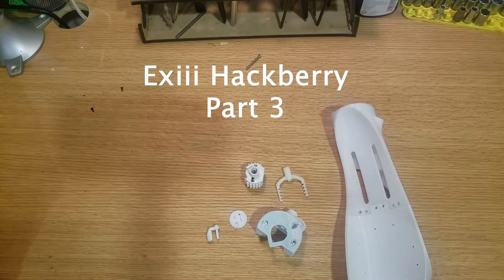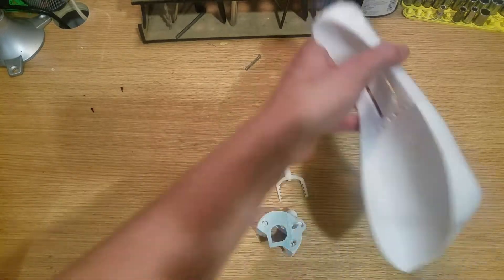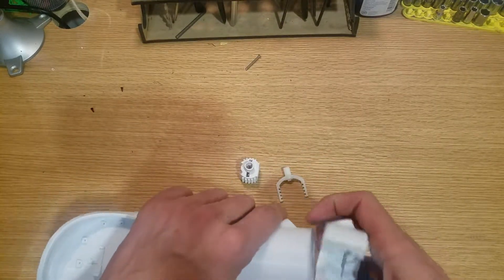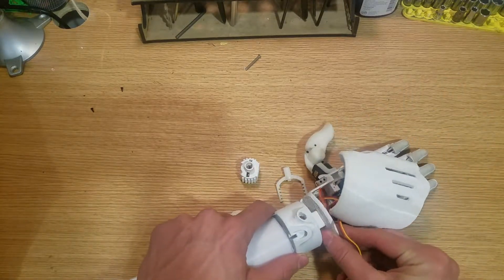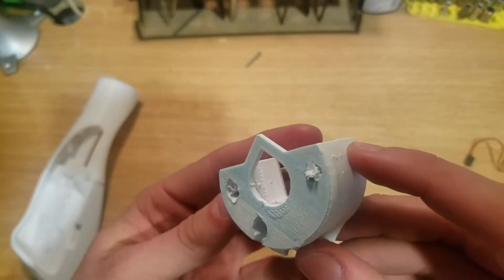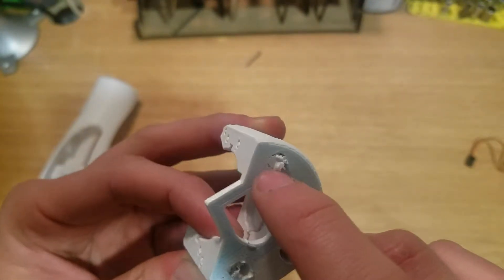What's going on everybody, we are back again working with the Exiii hand — this is the Hackberry. Today we're going to assemble the wrist element, which is going to provide a mechanism for the rest of our hand to attach on to. Our first step is to get some of the residual plastics inside our holes here filed out and cleaned up.